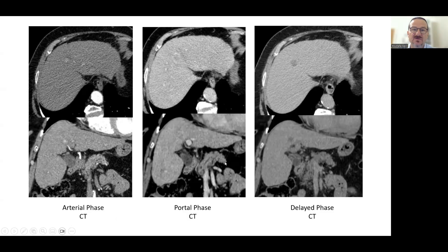Enhancements can also be evaluated by CT. You can see the early arterial contrast enhancement, peripheral capsular enhancement, and central washout, and in the delayed phase, total washout of the lesion.